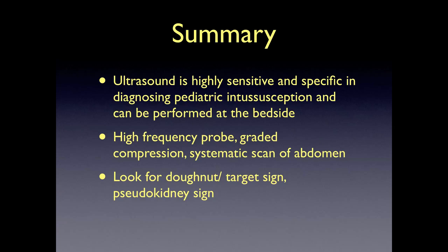In summary, ultrasound is highly sensitive and specific in diagnosing pediatric intussusception and can be performed fairly easily at the bedside. A high-frequency probe is recommended in order to visualize the relevant anatomy, along with graded compression technique and a systematic approach in scanning the abdominal cavity.